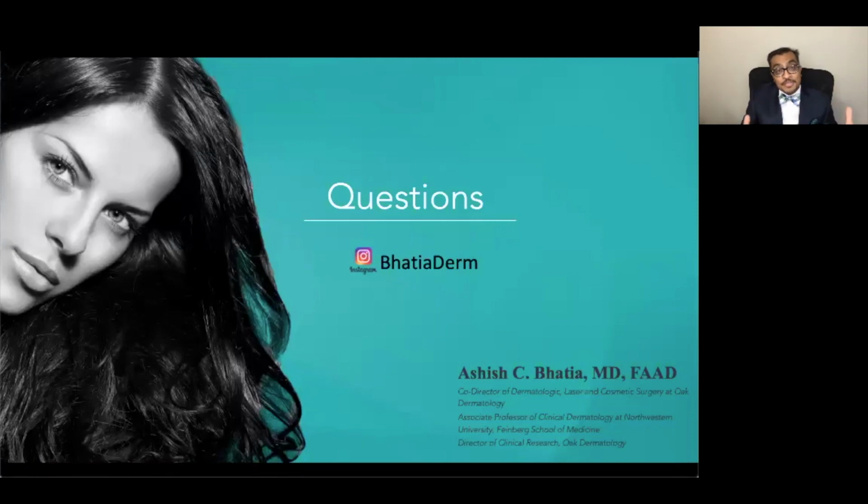So now we'll take some questions. Our first question is, how does the cooling help improve the swelling? Well, what the cooling does is help extract heat. And when you extract heat, you get a lot less collateral damage from the laser.